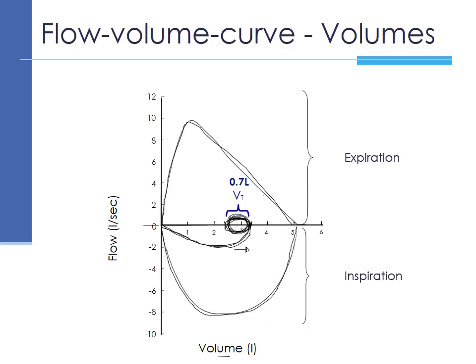Now, since inspiration is taking place at the bottom of the graph and the direction of inspiration was going this way, the part from 0 to 2.5 represents the inspiratory reserve volume. So that is the volume left to inspire after normal inspiration. In this case, reading off this graph, it is about 2.5 liters. Remember, it's also read on the x-axis because it's a volume.